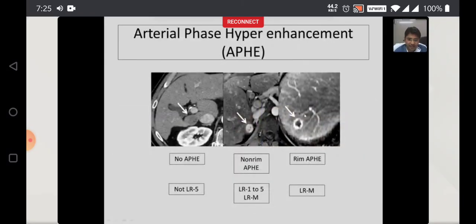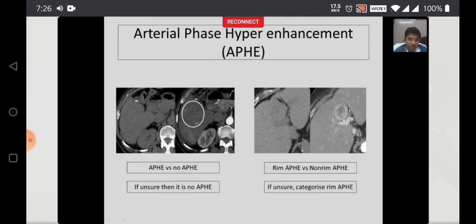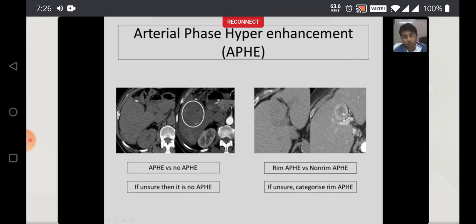Arterial phase hyperenhancement: there are three examples. The first shows no arterial phase hyperenhancement — this is not going to be an LR5 lesion. The second is non-rim APHE, meaning the lesion shows full arterial enhancement — most likely to be HCC. The third is rim arterial phase enhancement, which falls into the LRM category. If you are unsure whether there is arterial phase enhancement, say there is none. Similarly, if you are not sure whether it is rim or non-rim enhancement, categorize it as rim arterial phase hyperenhancement, and these patients may need biopsy to determine whether it is an atypical HCC or another malignancy.